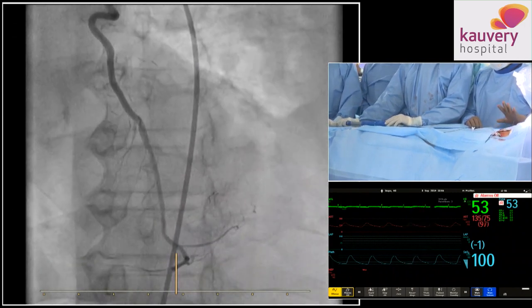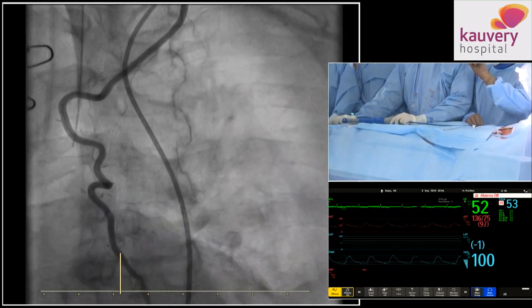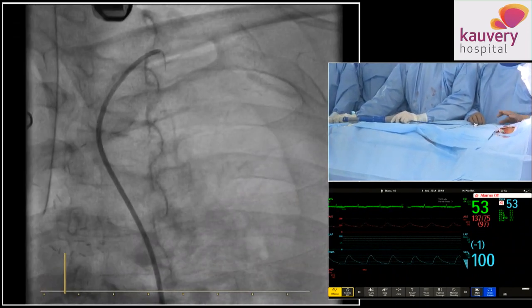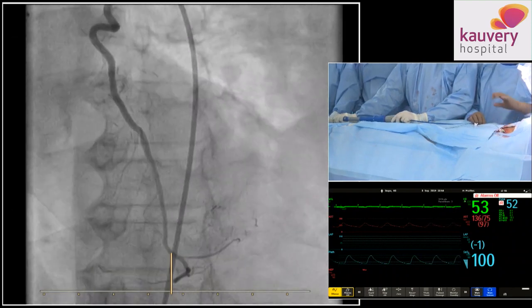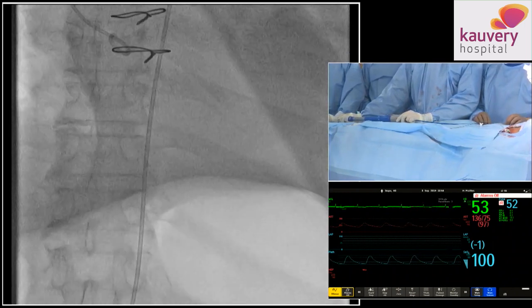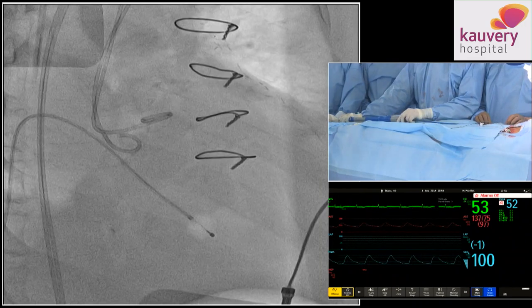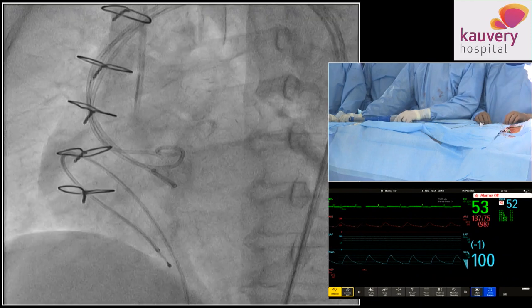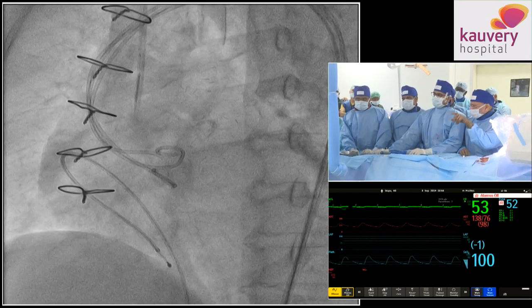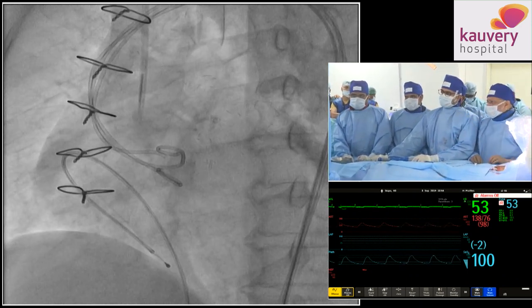Once we have all this in position, we thought let us have an extra cautionary step by doing a lima check with 3 ml contrast. We did this lima check just to be sure that we have a functioning lima, because if lima is functioning, generally we are fine. And we can also see some other flows happening through this. Next, please. Once the lima was checked, next we put in the pacing lead, and these are the two pigtails you can see which have been positioned here. Although I totally agree with you that they are not representing the true sinuses on both sides, definitely the non-coronary is in good position.